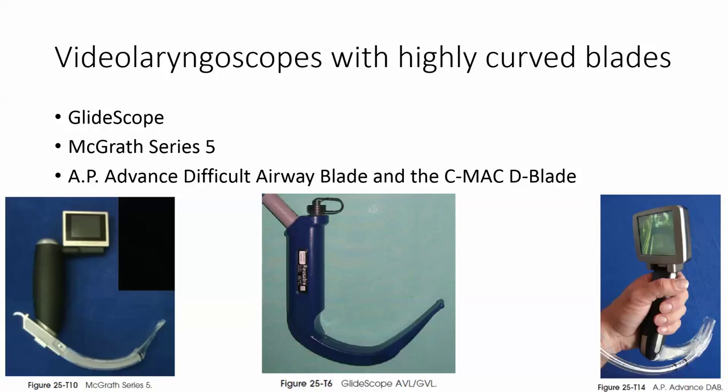And as you are all aware, having used glide scopes, the use of a shaped tube, which directs the shaped introducer, directs the tube into the glottis, and then under direct vision the tube is advanced.